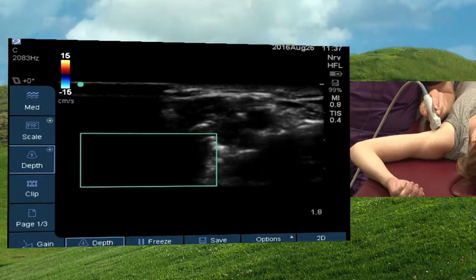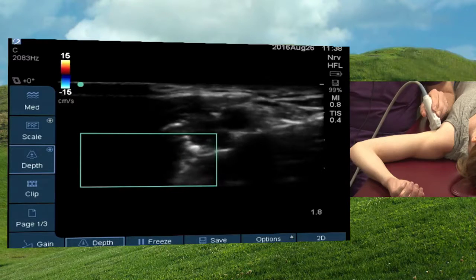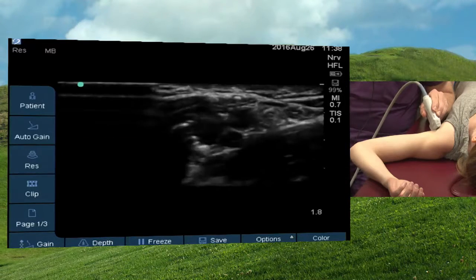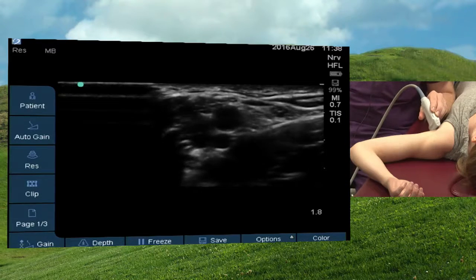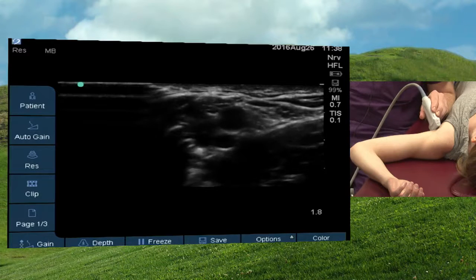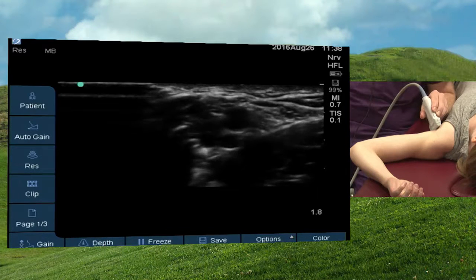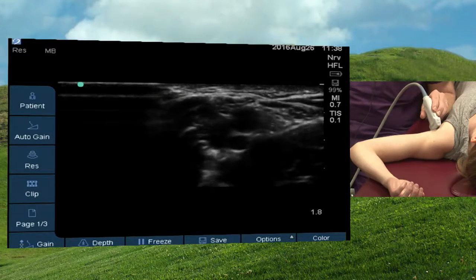It's either that one, and with the musculocutaneous nerve, it's more of a kind of a guess where you're going to block. But what they would do with a transarterial approach is you would palpate the artery, and then you would stick a needle into the skin and start aspirating. And as soon as you got blood that started to come back, you're aiming for the artery. And so you're going to go through the artery, get blood, and as you continue to aspirate, once you get to the other side, the blood stops and you know you're in the right spot.